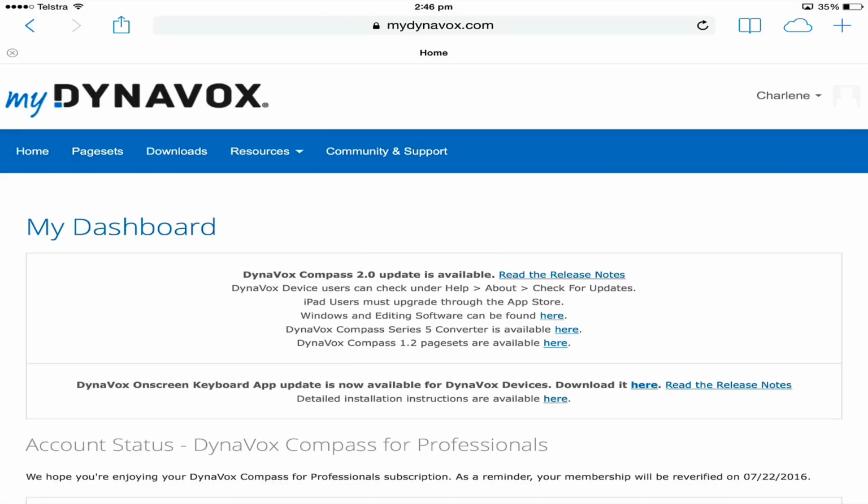Now I want to talk to you a little bit more about your MyDynavox account. This is really important to create one. It's equally important to remember the email address and the password that you use to create this MyDynavox account. So store that somewhere, because you will need that every time you log in. Also to log in and out of different devices that you might use, and also if you need to use that email address to tell someone so that they can share pages with you, they will share them using that email address.